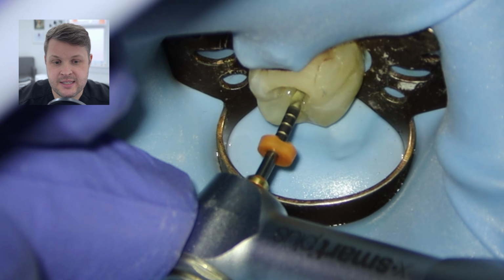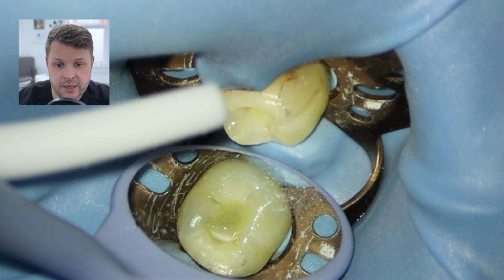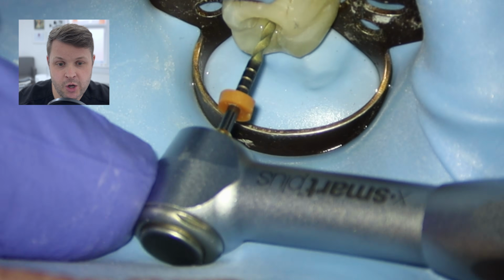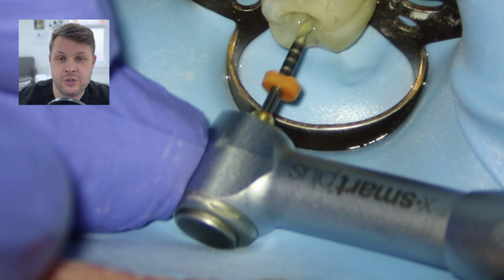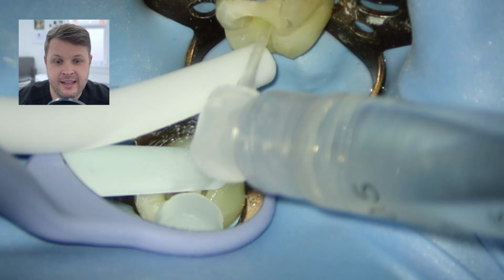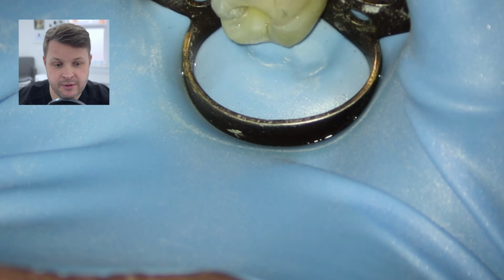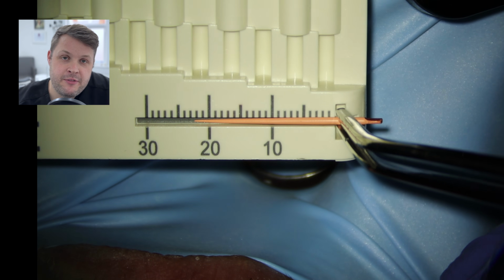And again, it's the same sort of protocol. We're going to use our size 20 this time, because we know this canal's quite open. We don't need a glide path file. Then we use our 25, and then all 4 canals are shaped, 3 or 4 depending on how you see it. And now we're ready for our cone fit radiograph.